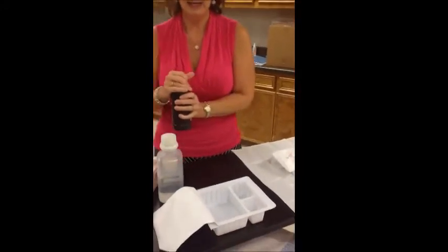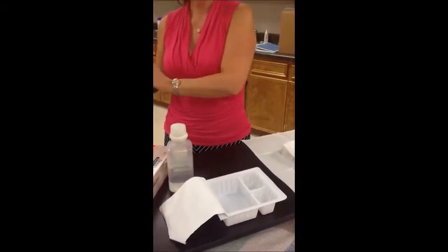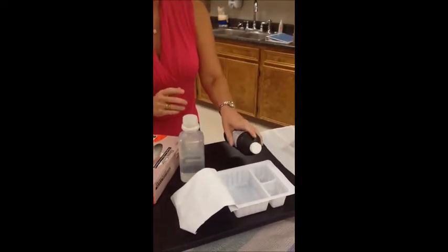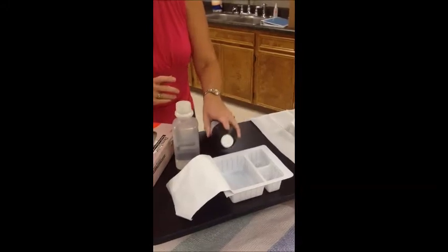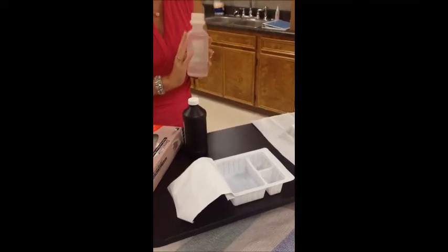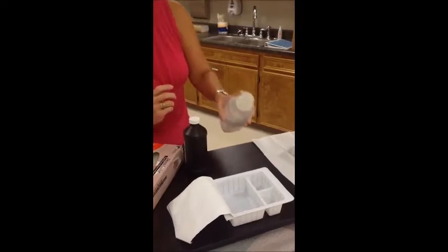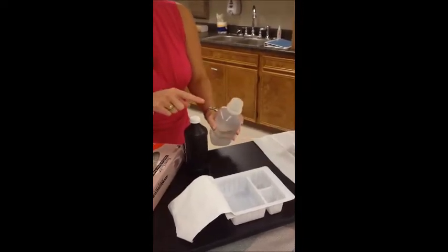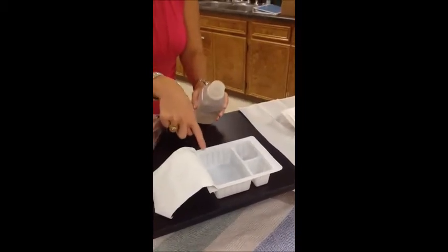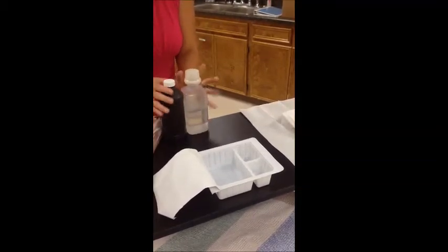I'm going to take my peroxide, check the expiration date, put the label in the palm of my hand, lip it if it had been used before, all those things that you know how to do. I'm going to put peroxide in one and a little bit in the big one. I'm going to take the saline, same thing, check the expiration date, make sure it hasn't been in the room too long, lip it if needed into a garbage can. I'm going to put saline in that second one. So we've got peroxide here, we've got saline here, and I'm making a mixture of saline and peroxide in here. Alrighty, so we're done with that part.